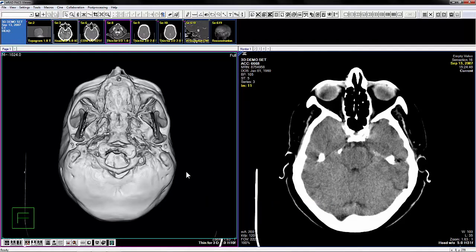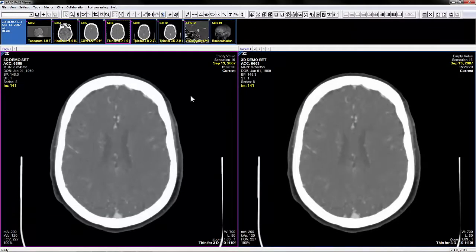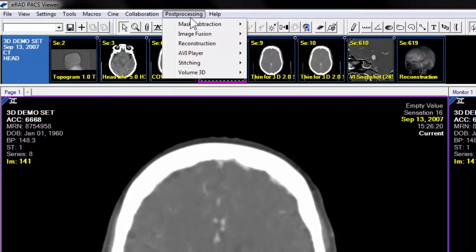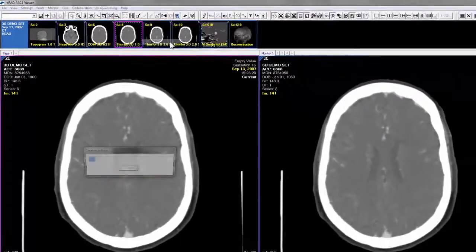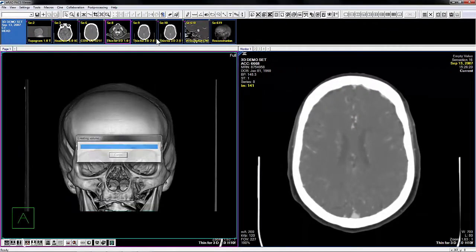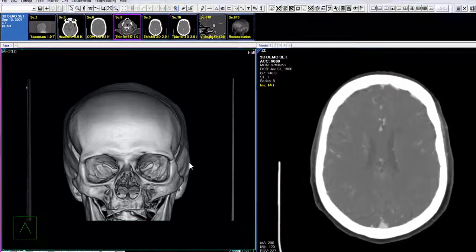Your server will need to be licensed and your user account enabled in order to use the 3D plug-in. To access the plug-in, navigate to the post-processing option in your viewer's top menu and select Volume 3D. Select the reconstruction option you wish to apply. Before we get into the details of how the plug-in is used, let's take a moment to review the plug-in frame's layout.